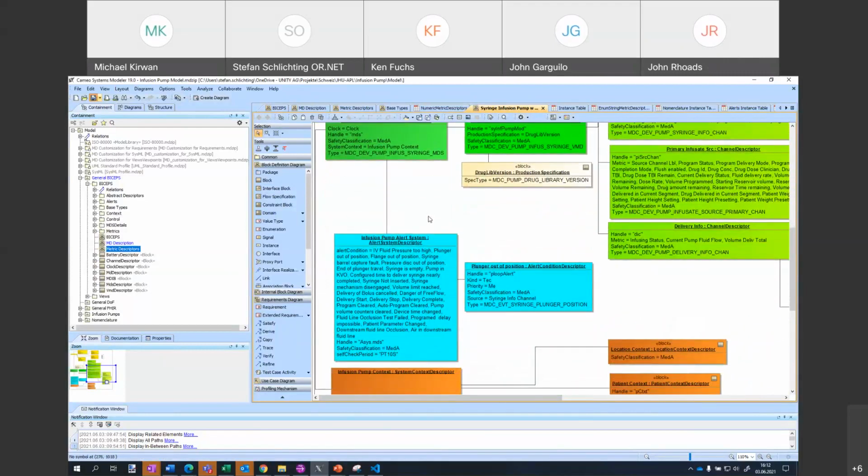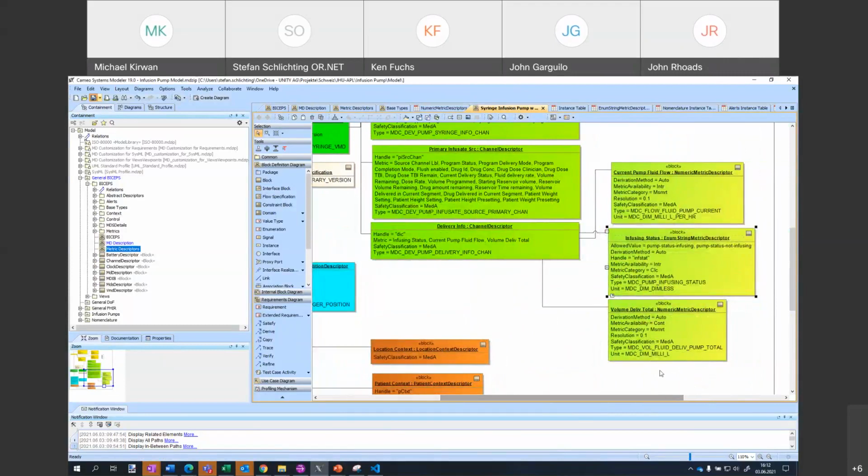Stefan, a quick question with the units. Sure. Would you at that point in the model put all possible units, or is it just a sample? For example, for the infusing status, you have dimensionless. If there were other units used there, would that be listed under the unit equals? Yeah, so this tool is designed to create one specific description.